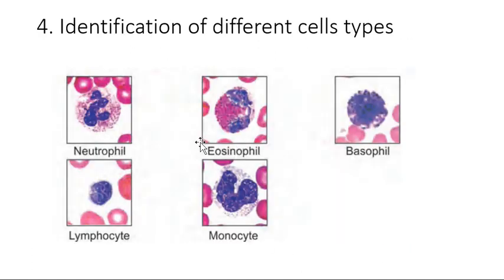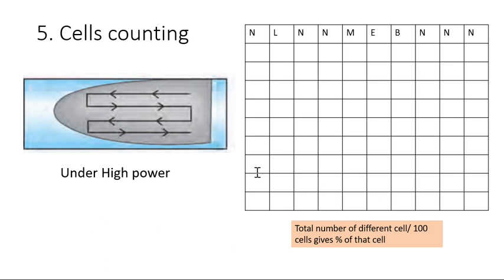Once you have done this, you have to identify different cell types. I'll be making one more video to identify different cells and their different properties, so we will not be discussing it in this video. The next step is cell counting.